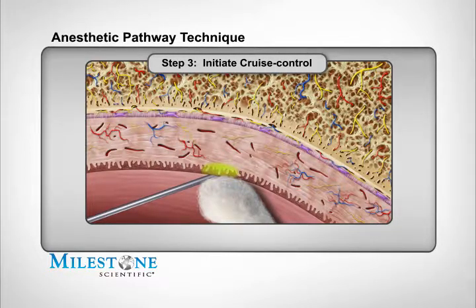The technique of allowing anesthetic to contact and diffuse through the outer layers of tissues produces a topical anesthetic effect, numbing the surface. Do not allow the needle to puncture the tissue at this time. Continue to allow the needle to stay on the surface for another 5 beeps before initiating needle penetration.